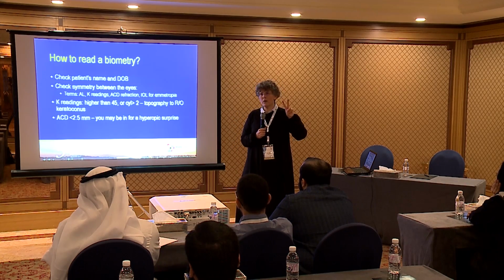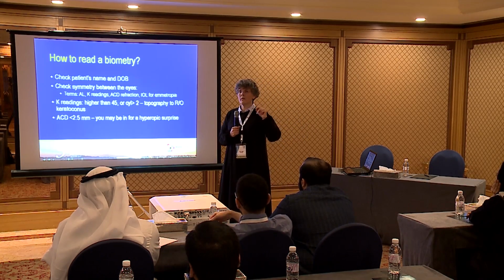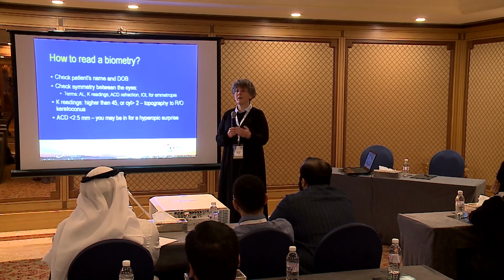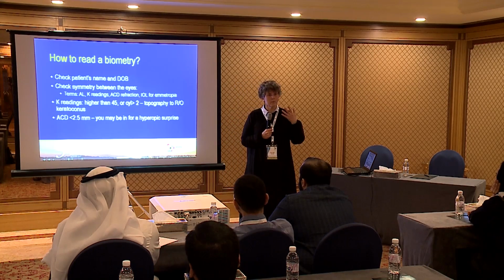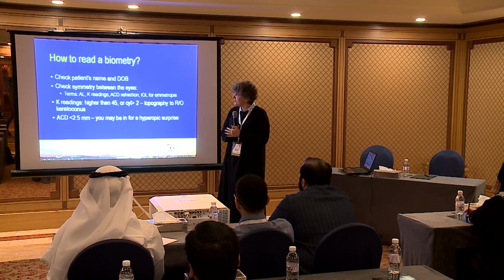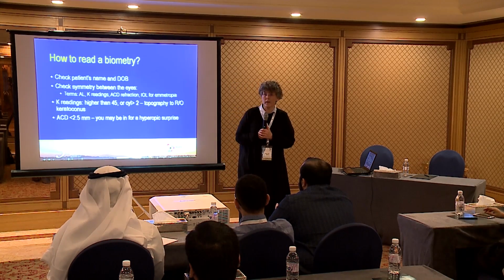But because of our checkout procedures, our timeout procedures, the patient had to give me his date of birth. And I looked at the biometry and said, this is not the same man. And I could prevent a mistake. So please check it and check it again in surgery. Okay? Then check symmetry between the eyes.